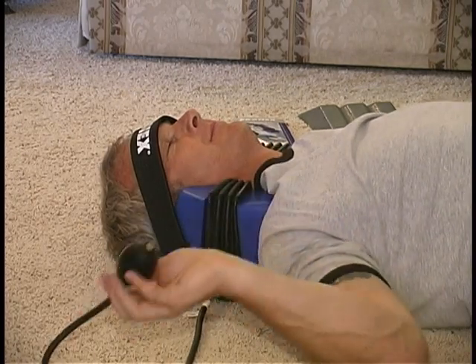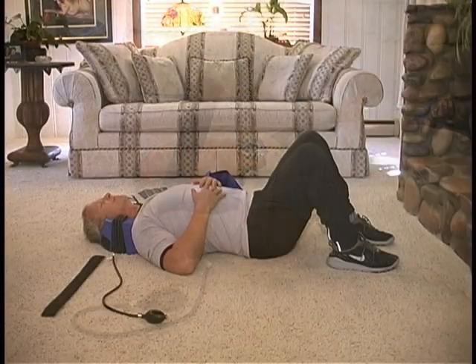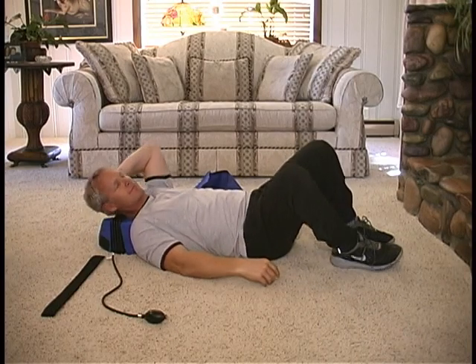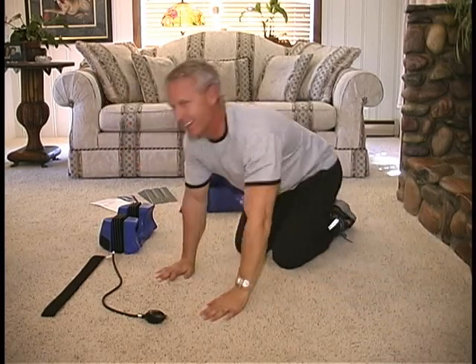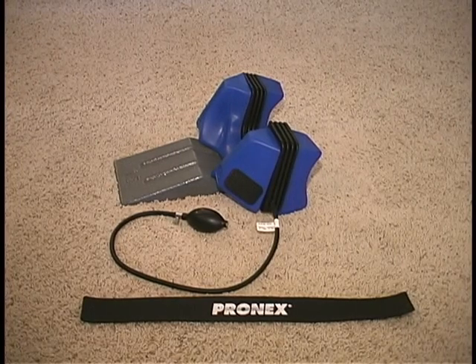Now remove the head strap from the Velcro on one side and then the other. Using one hand to support the head and neck, roll out of the unit to one side, freeing yourself from the PRONEX area. Congratulations! You have successfully completed the PRONEX Pneumatic Cervical Traction Therapy. A gray flexion wedge has been provided as an option for angled therapy if prescribed by your doctor.